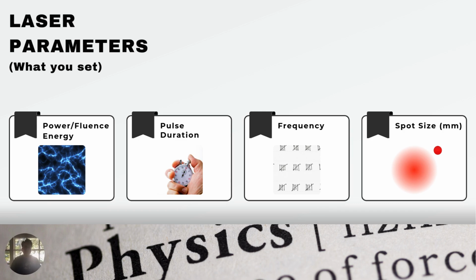This next topic that we will be discussing is laser parameters, and this is what we adjust on your laser. These are the most common ones found in any laser system, and as such, I expect all of you to get familiarized with them as each of these will impact your treatments.